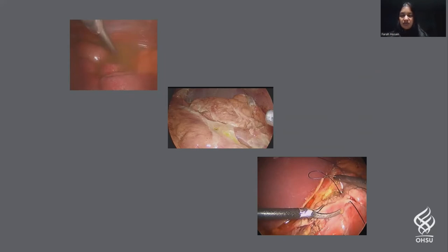In the bottom corner you see there, we have found a defect. In this case, we are putting some sutures in primarily, but we're also going to likely patch over the top of it and lay a drain very close by. So multiple steps to think about. And then finally, before we leave the operating room, we think about what kind of enteral access we can do so that the patients can be fed and given robust nutrition.